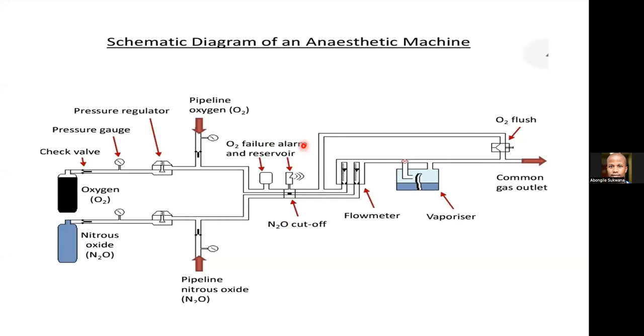Can anyone tell me what is a manifold and how it works? Remember we said the sources of gas could be manifold, cylinders, and pipeline. How does a manifold work? Let's talk about the manifold for oxygen. What is it and how does it work?